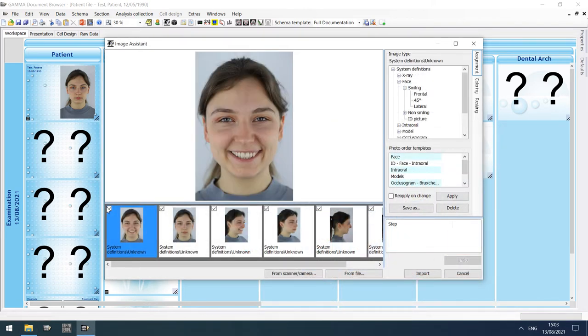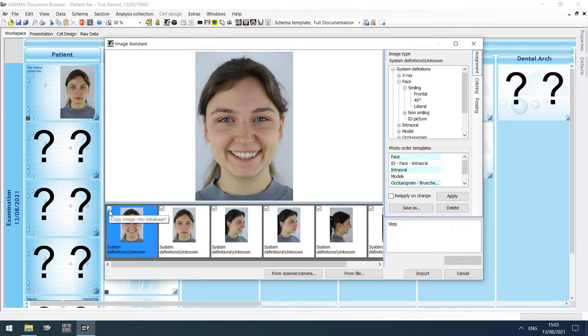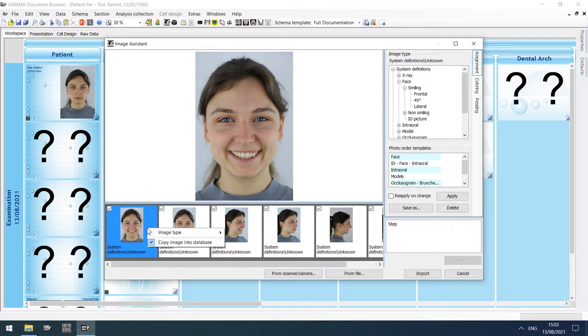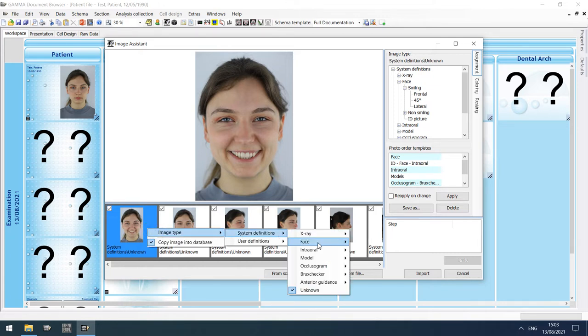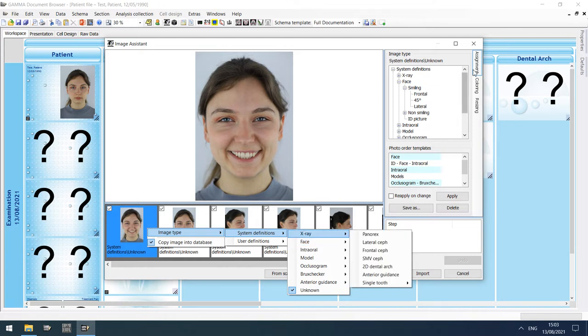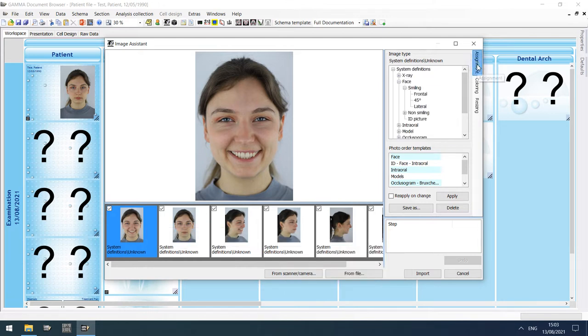To exclude certain images from the import, you can uncheck them in the preview bar. For the remaining images, specify the appropriate image type either via the context menu or via the assignment tool window.